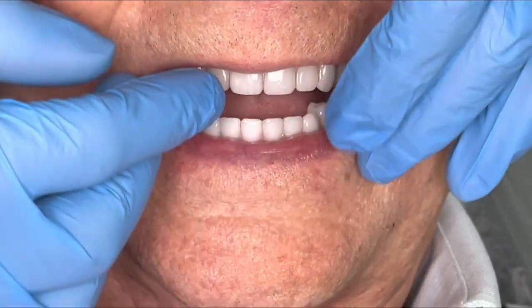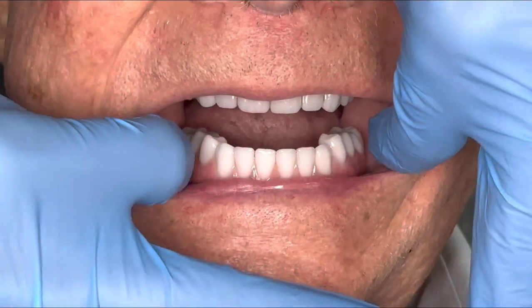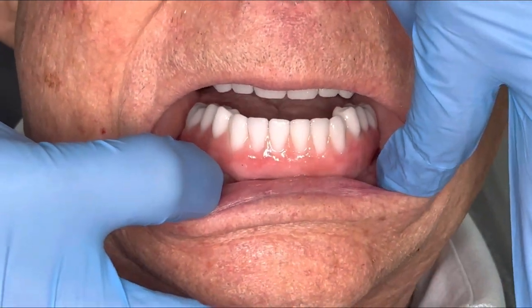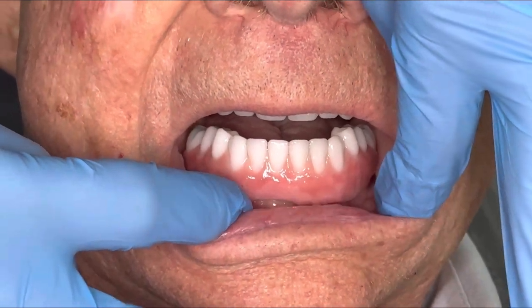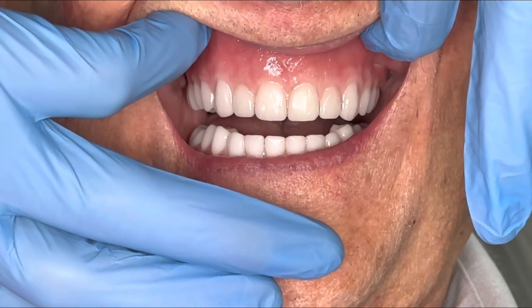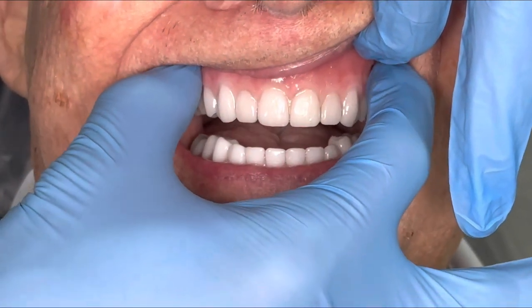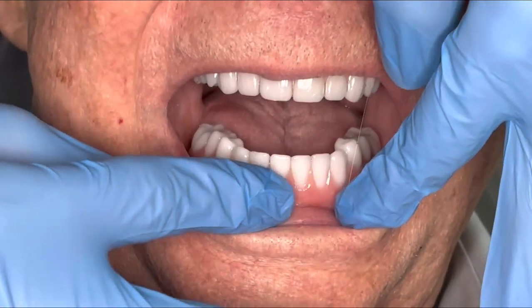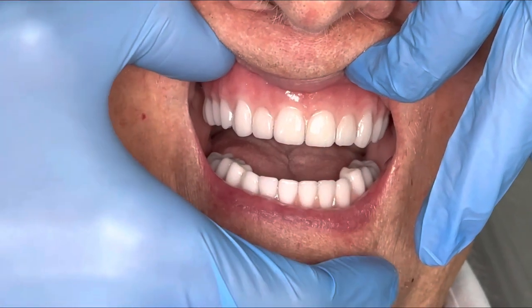Perfect. All right, so today we're going to show a digitally designed implant retained overdenture that we've made. And this is a 3D designed upper denture. The upper denture was actually milled and the lower was 3D printed. So we're going to show you, got some really nice retention on this case.